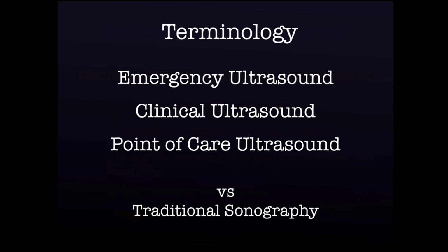Point-of-care ultrasound is the one you see mostly in the literature, and it's a really good term because you're using it right at the point of care. You're making a decision based on the ultrasound and affecting their treatment, so that's a great term, and I don't have any problems with that. It just seems like clinical ultrasound or clinician-performed ultrasound sounds a little bit more encompassing to me. But we contrast this to traditional sonography. So traditional sonography is very different than what we're doing.